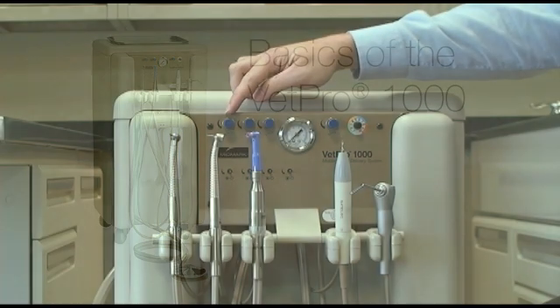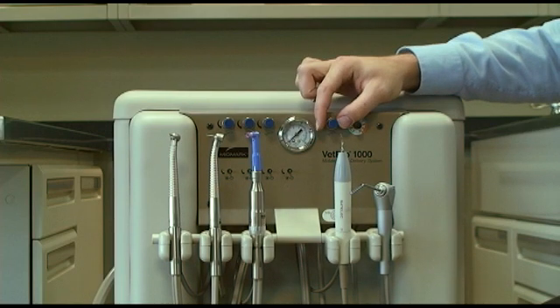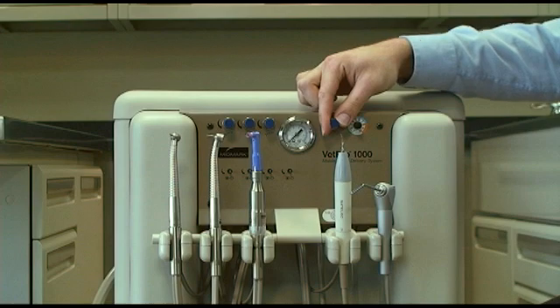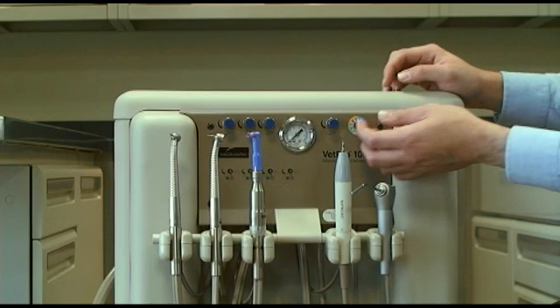First, let's take a look at the water needle valves. These valves are used to control the water flow to the handpieces. To the right of the valves, you'll find the scaler adjustment, used to control the intensity of the scaler.